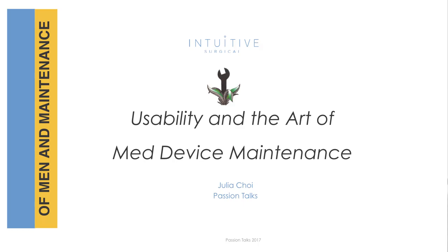Just as a quick background, human factors, I don't know if you've heard of it, the big premise behind human factors is that it's very, very typical for engineers to blame the user. Human factors is supposed to be against that, against blaming the user. It's not about user error, it's about use error. So how can we improve the design so that we don't put our users into difficult spots?